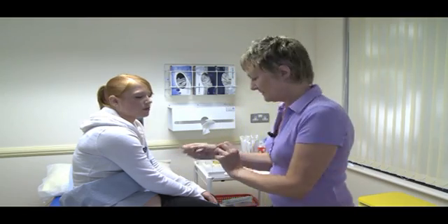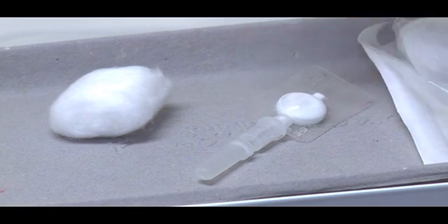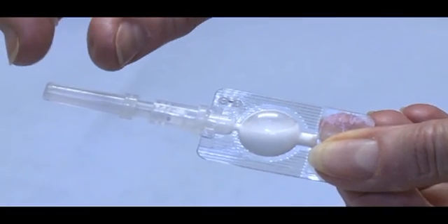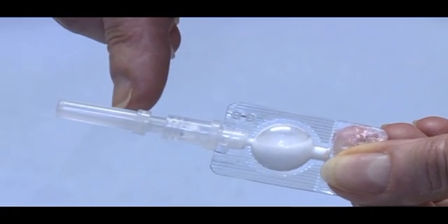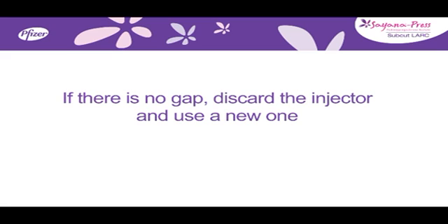When you are ready to give the injection, carefully tear open the foil pouch and remove the injector, but don't remove the needle shield at this stage. It is important to check the injector as follows: the needle shield should be in the position shown and there should be a gap between the end of the needle shield and the port. If there is no gap, discard the injector and use a new one.